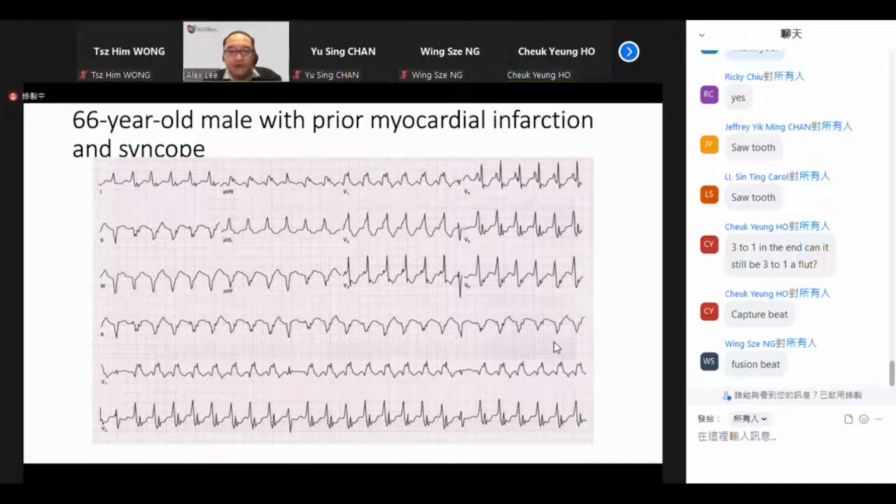Right. So let me explain it more clearly. In patients with VT, the whole conduction system is driven by the ventricular complex, right? There's a ventricular focus that keeps firing and therefore capturing the whole heart. The sinus node actually is also still functioning, but it's just too slow.